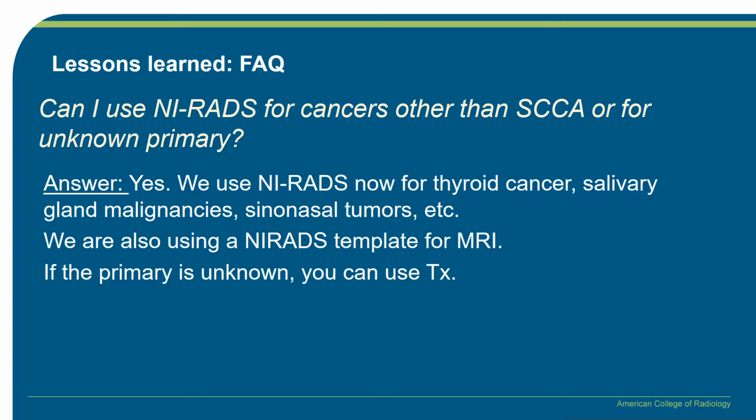So can I use NI-RADS for cancers other than squamous cell carcinoma? Yes, I've just shown several examples. If you are just starting to use NI-RADS, you may want to start small with this subgroup of squamous cell carcinomas so that you can gain some experience first, and then broaden your template for other head and neck cancers.